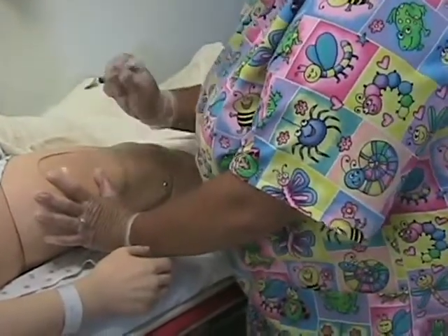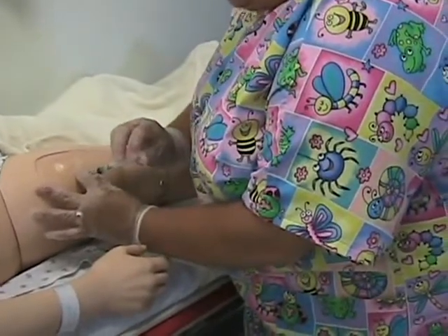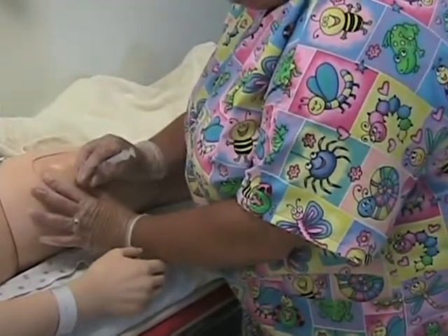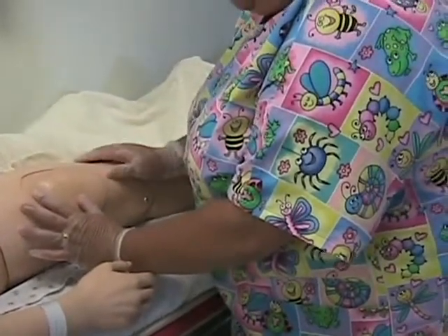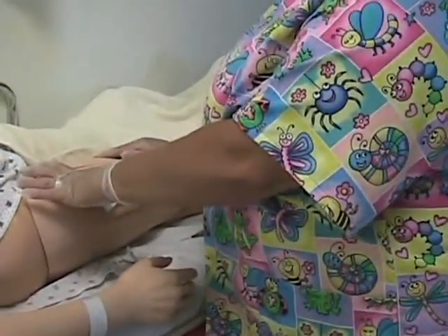And then what we're going to do is go ahead and dart it in at a 90-degree angle. Take our non-dominant hand, hold, aspirate, no blood, give it 1 ml within 10 seconds. Go ahead and hold the skin again, pull out, go ahead and leave our needle, grab our 2x2 gauze, hold, but do not massage.